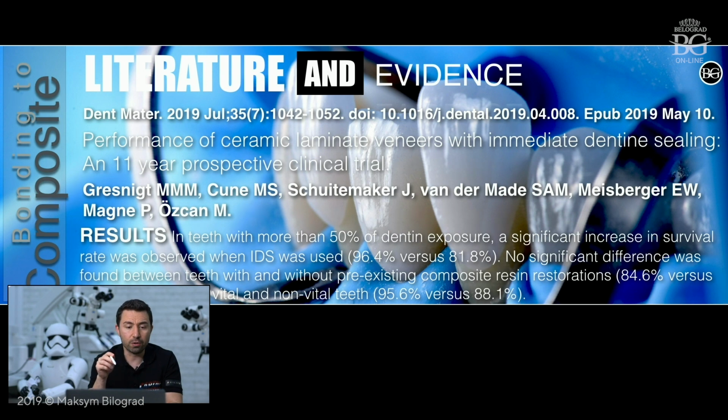So many people are still really afraid to do that kind of combination, but nowadays we have clinical experience and clinical follow-ups, but also we have evidence where you can find a lot of articles. One of these articles I'm sharing with you proves that the combination of ceramic and composite works.